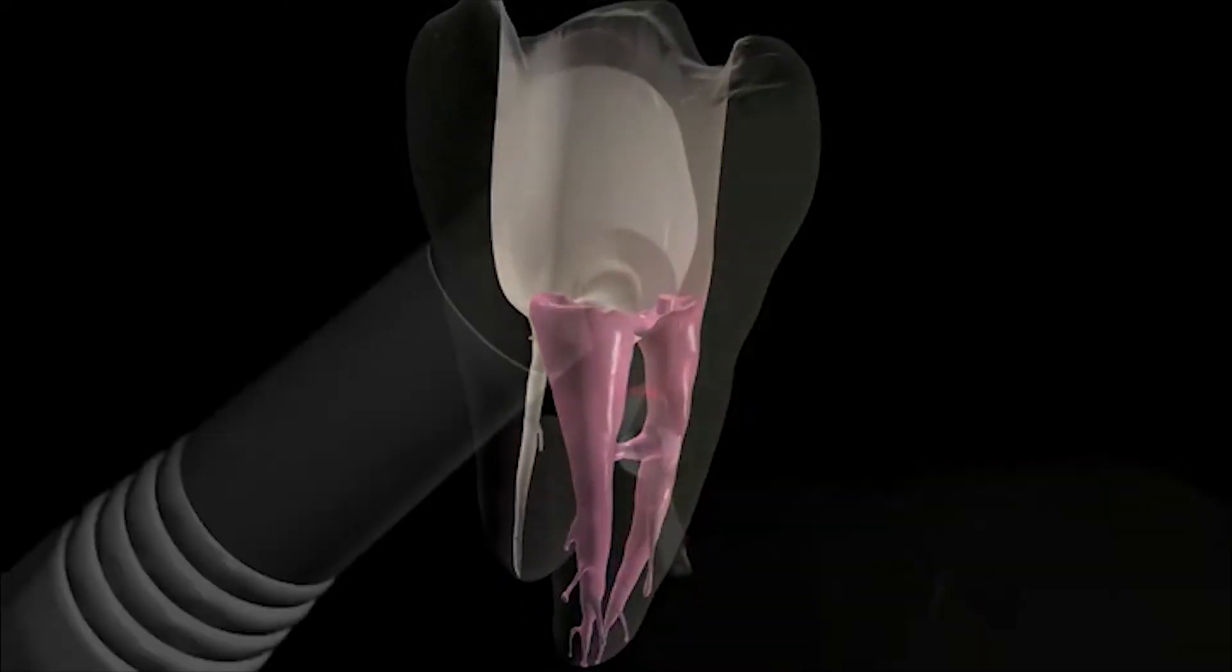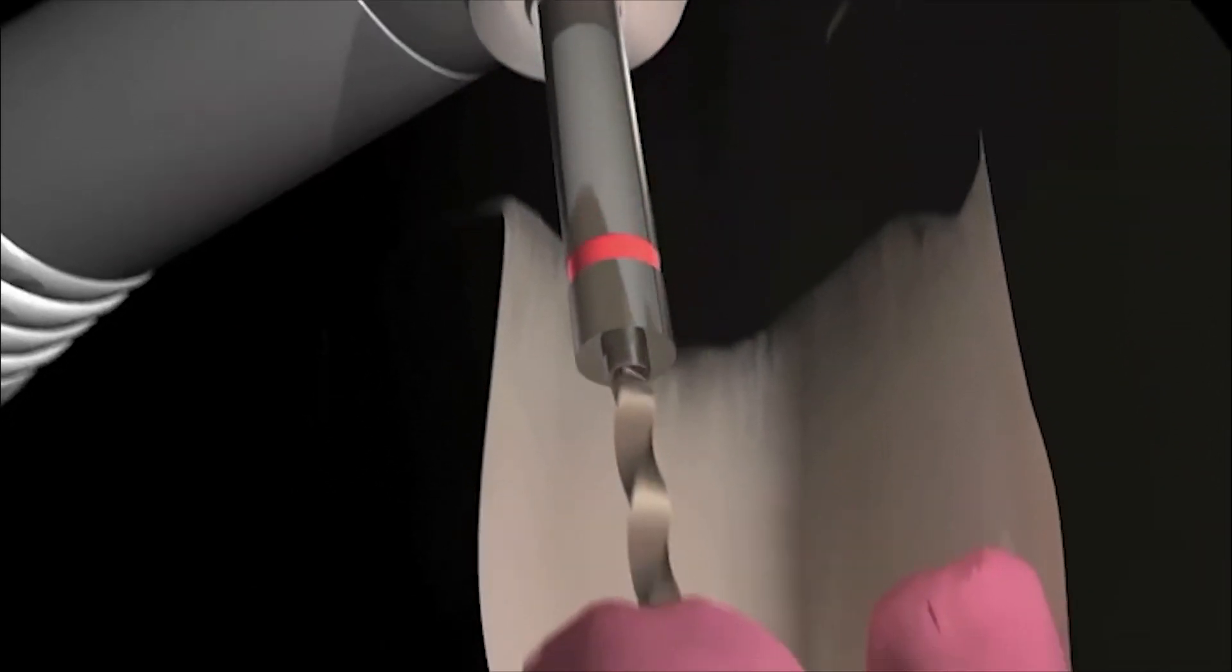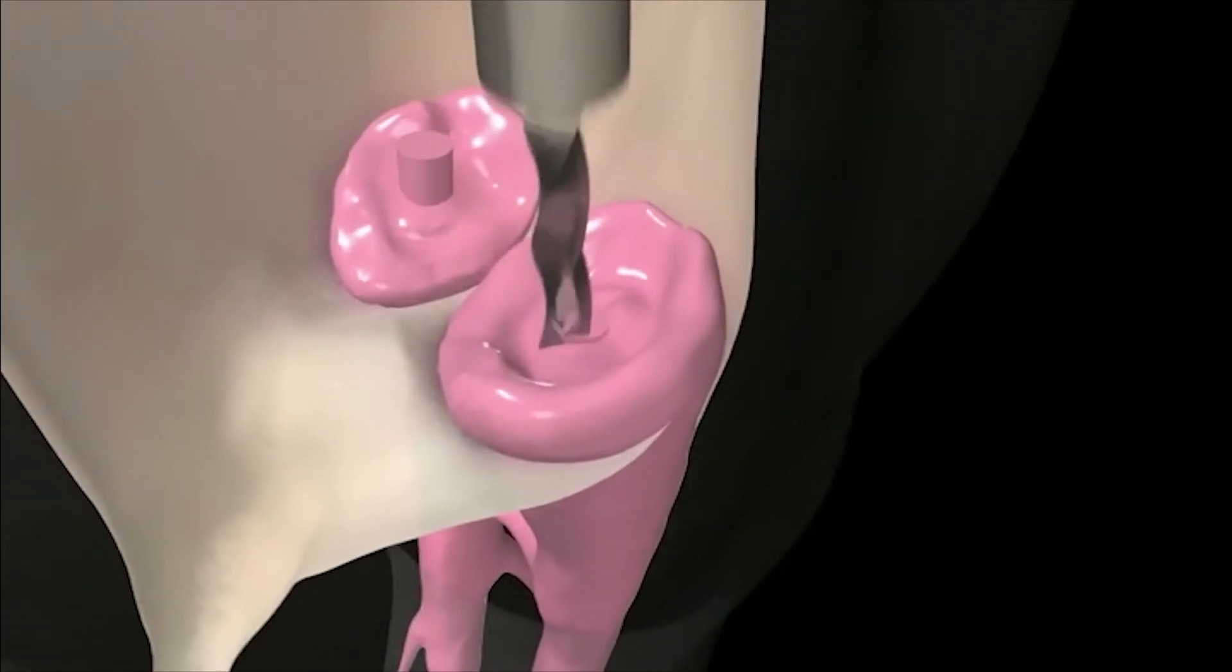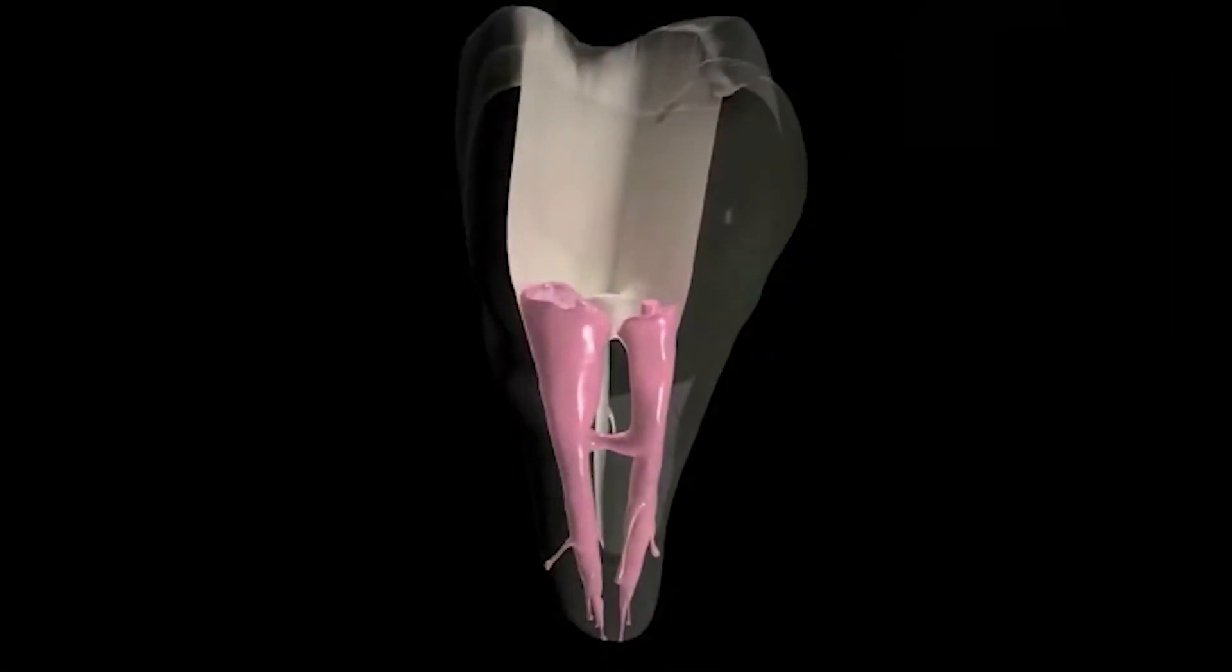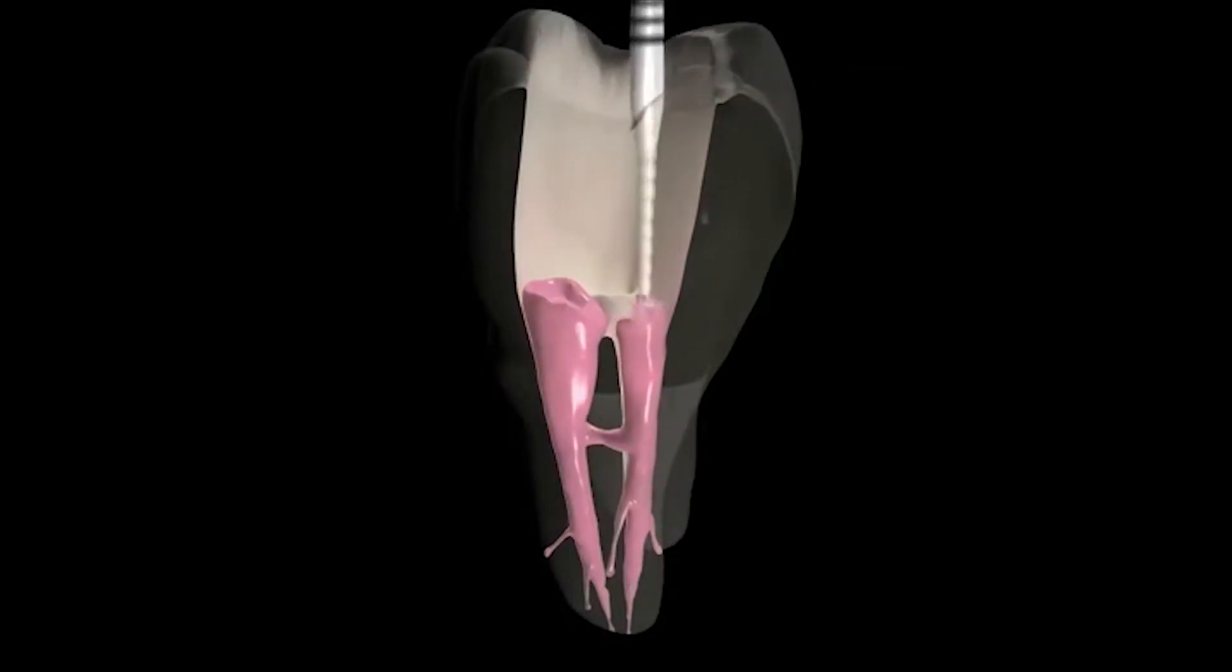Guttapercha Core obturators remove easily like Guttapercha because they are Guttapercha through and through. You'll see the familiar shredding characteristic, whether you're creating post space or retreating.